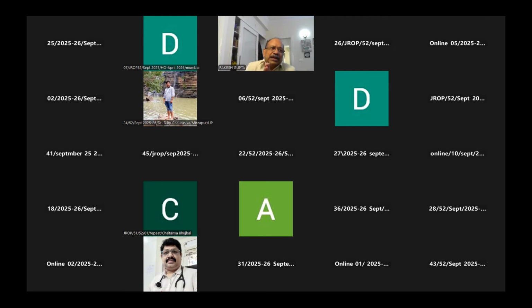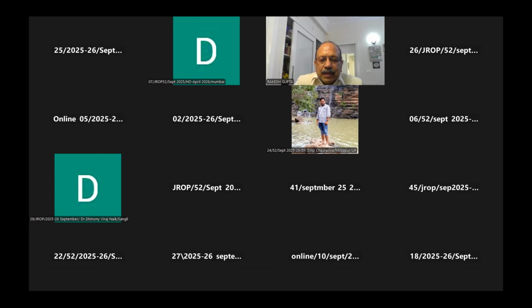What exactly happens is some people ask you, what is my wall motion score index? So normal segment, let me get back to that presentation, because once you see that, then you will get a better idea. I've touched this topic for the first time over here. Otherwise, I never used to touch it, because some people asked this question last time.